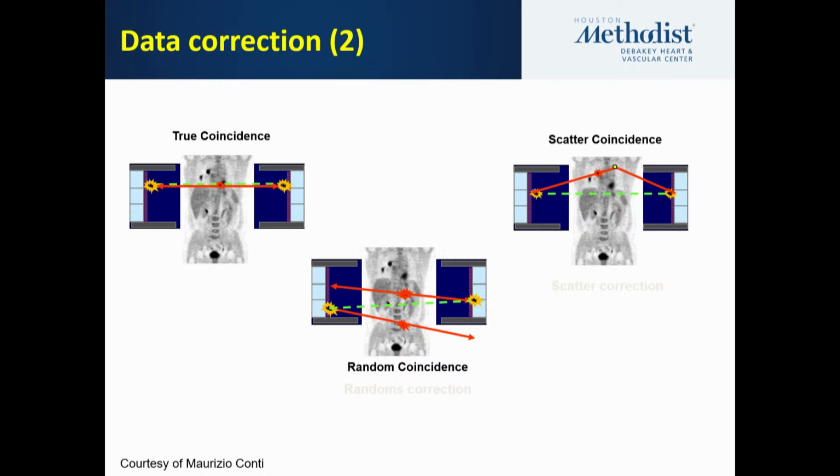One of them is going upward, the other is going downward, and the software, or the machine, may potentially place it as coming from the wrong place. But there are also some algorithms that should help in getting rid of these.